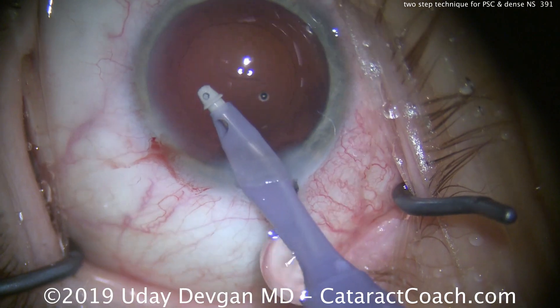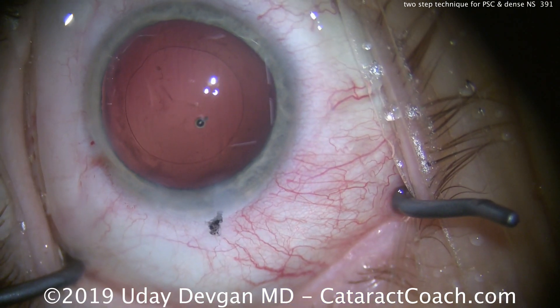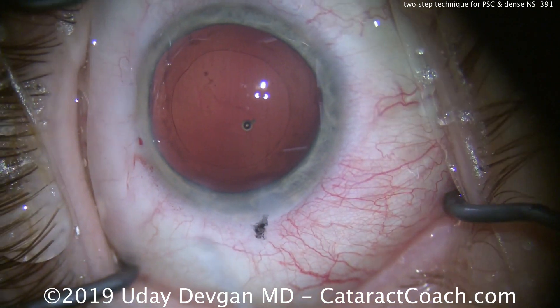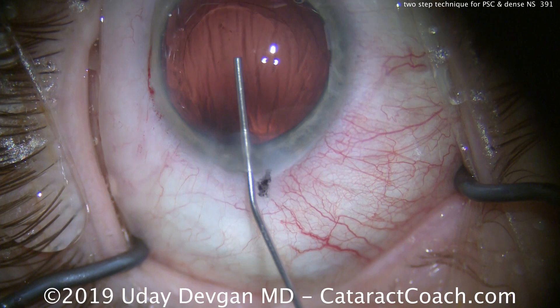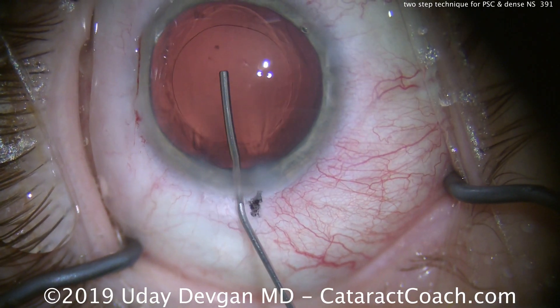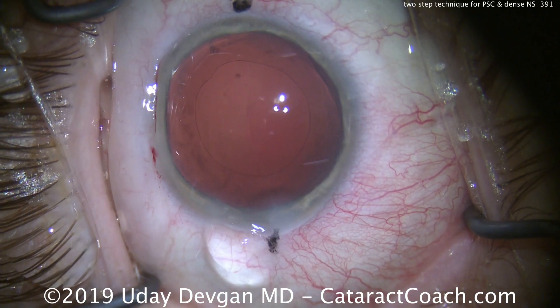Now we're prepared to put our lens in. Cleaning up again, removing the viscoelastic. There you can see the outline of the rhexis — that looks just about perfect. We're going to fill the capsular bag with our cohesive viscoelastic. The outline of the rhexis again looks spot on.